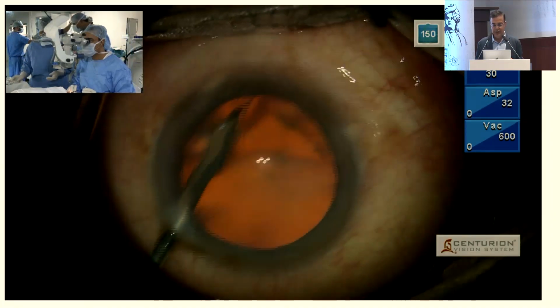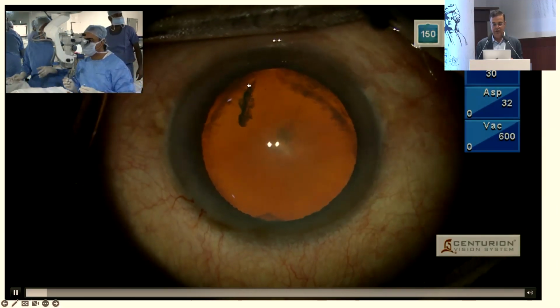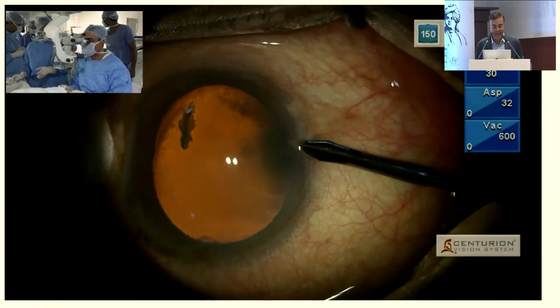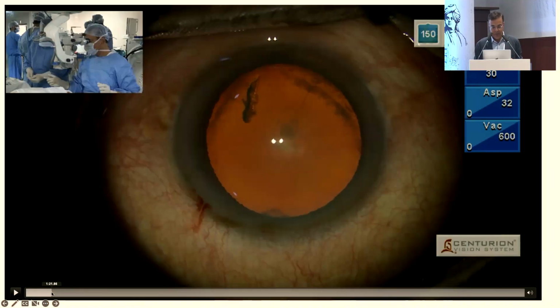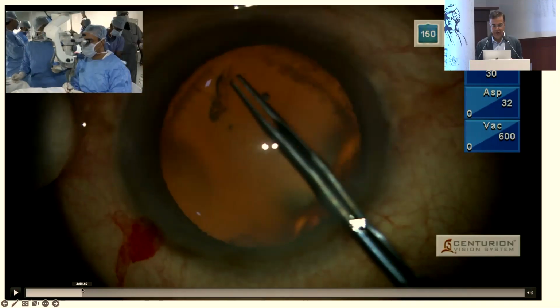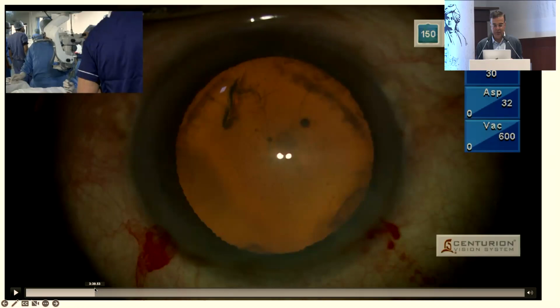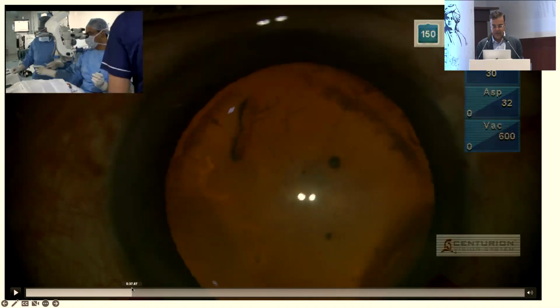I go in, and because it's not sharp, it just goes and punctures it. Now I have a very peripheral puncture. It's going all the way till there. So I have to retrieve this, and I have like 5 top surgeons standing all around me trying to give me advice how to go about this surgery. And each one of them has different advice. So I tried to do something about it, and I went ahead with my other incisions, thought for a while what I should do, tried to see if I can hold on to it and bring it in, but it wasn't. It was almost radial. So there I'm trying to do something about it, but it doesn't go the way I like it. So then I start initiating a rhexis from elsewhere.